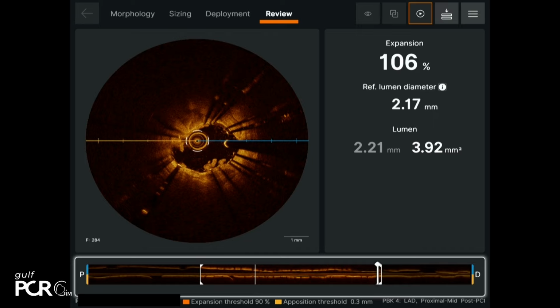You're the distal edge of the stent, right, in this image? Okay. Now we are in the proximal. We're optimizing the proximal one. Okay, we're following your advice, Ibrahim. We are seeing the OCT image on the screen, and we come back to the angio. Yeah, can we go to the angio? Can we show the angio, guys? How high did you go?